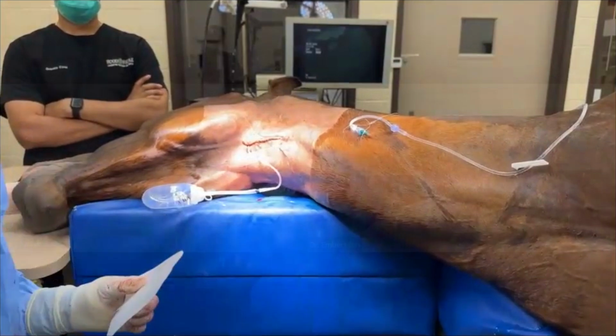Yeah, so usually the horse stays in the hospital for 2 to 3 days, and the reason for that is that I go in the next day with the scope and using the laser to remove the left vocal fold, and we just do that standing with the horse sedated. And then sometimes the incision, either in the throat that I do with the laser or externally here, will swell a little bit. So I like to watch that to make sure we're doing fine before we send the horse back to the farm.